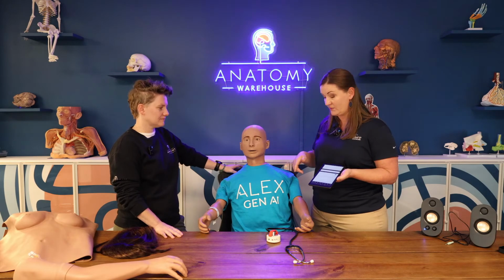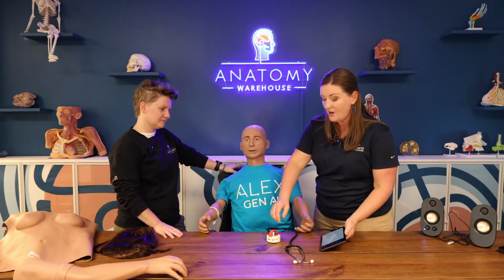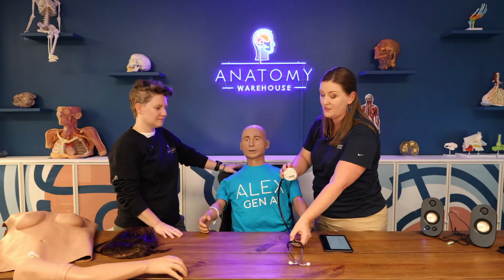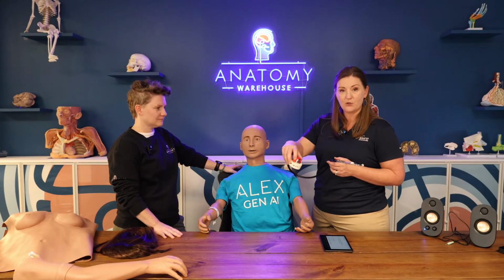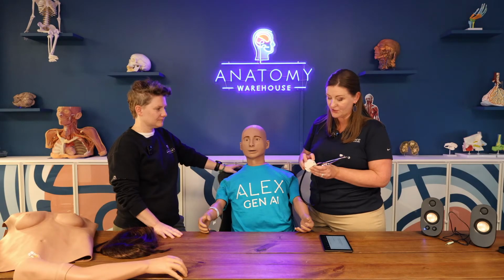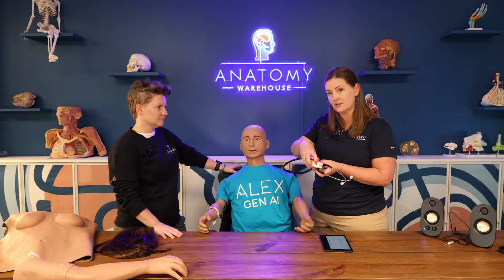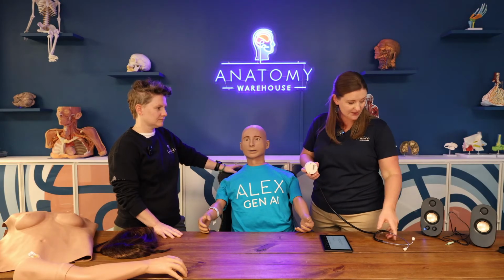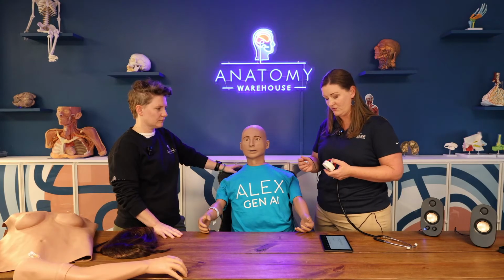Not only are the pulse points getting picked up within that simulation log, but also if you're auscultating with the smart scope, you can get those picked up as well. The smart scope is specific to the mannequin, and it has some really neat features. There's the power button, you can charge the smart scope, and this is a little speaker port. I brought a very basic set of speakers so it would be easier for the audience to hear the sounds coming from the mannequin.